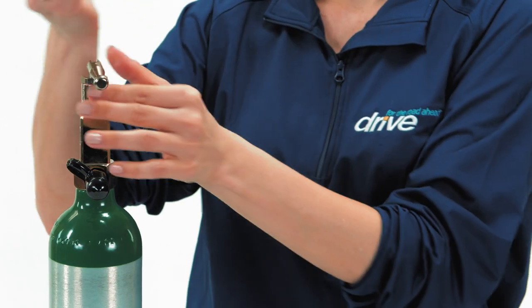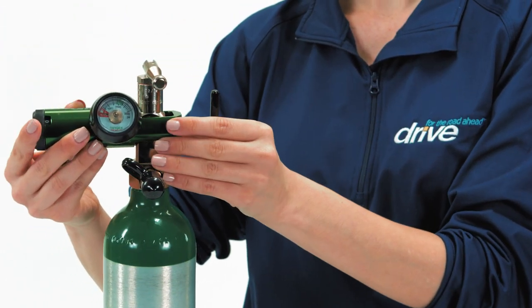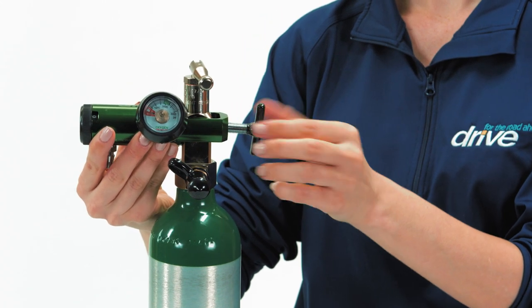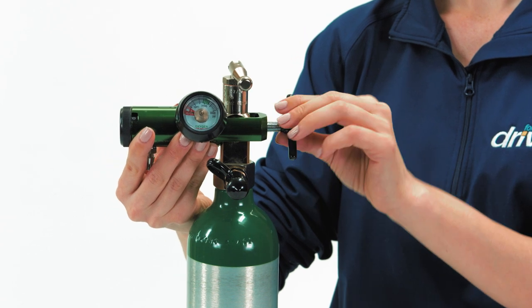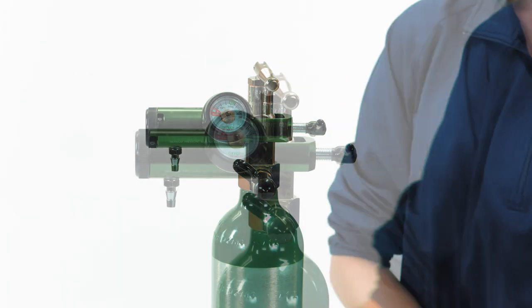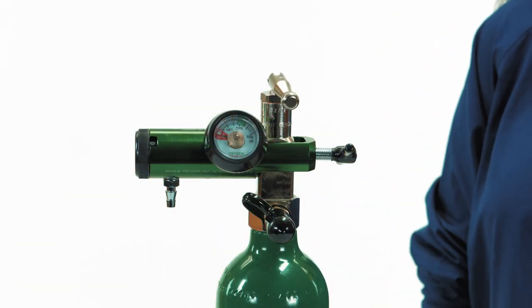Slip the yoke over the cylinder valve and align the pins with the holes on the cylinder. Turn the T-handle clockwise until the screw is seated on the dimple. Finally, hand tighten the T-handle to ensure a good fit. Make sure the regulator is in the off position and level on the cylinder valve.